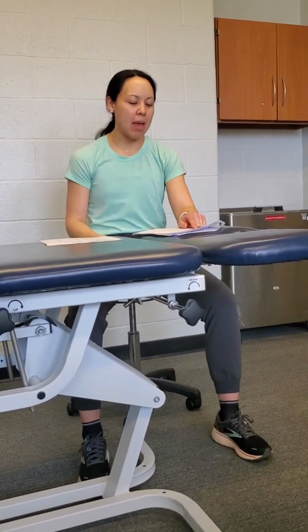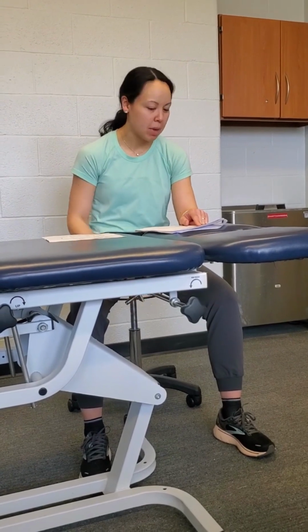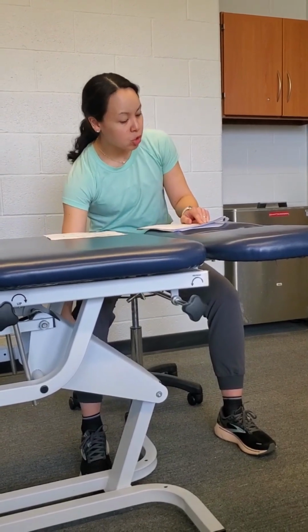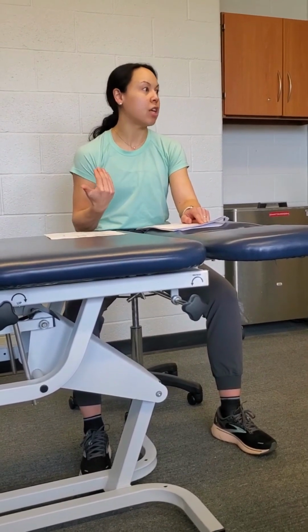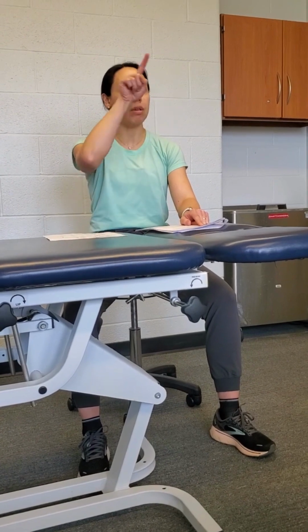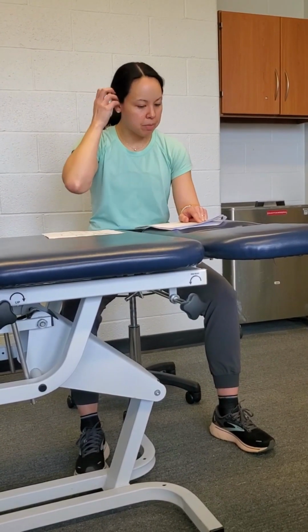So you really have to pay attention to what the machine's doing and what the patient's doing, which is not a bad thing. You should be paying attention to that anyways. During the 30 seconds of rest though, the cuff stays inflated the whole time. It's not until they're completely done with those 4 sets that you want to deflate the cuff.